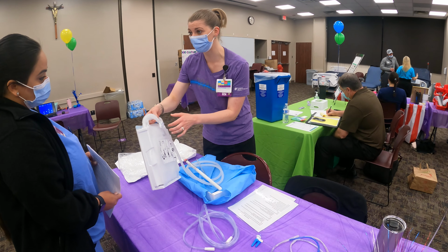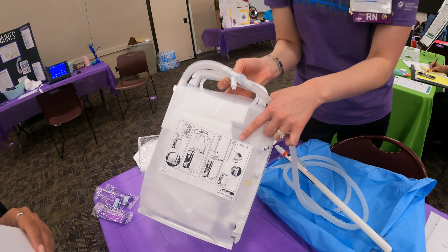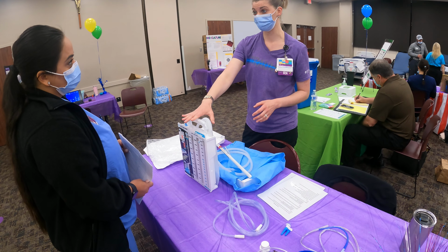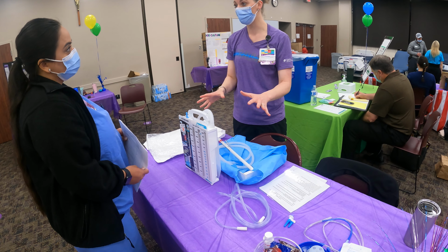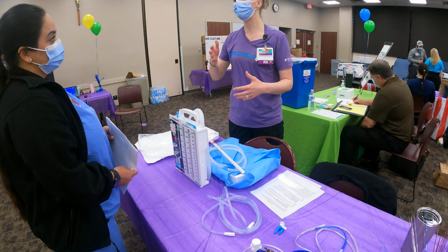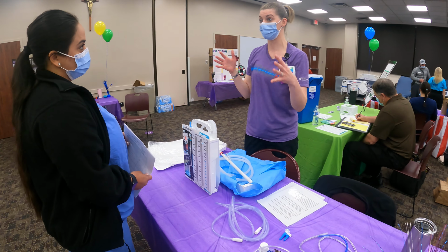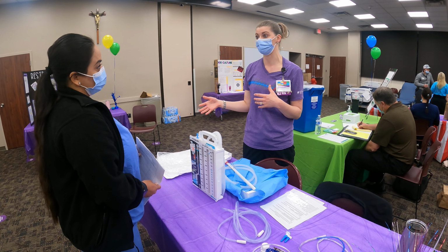And if you ever forget how much to set it to, you can actually look on the back of the chest tube. So anything greater than 80, okay? If they're hooked up to suction, that's what it needs to be set. Right? If they're hooked up to suction, we really don't want to disconnect them from suction at any time. Okay? They can get up, they can mobilize within the space that this tubing allows them to go, but they need to stay hooked up to suction as much as possible.